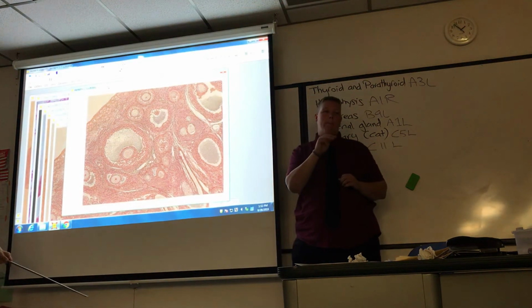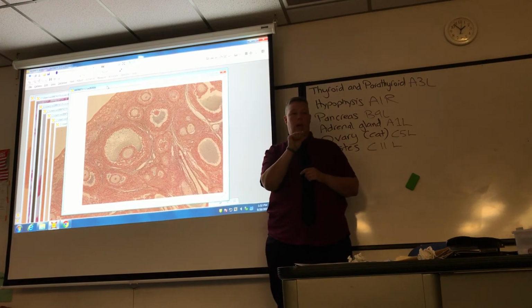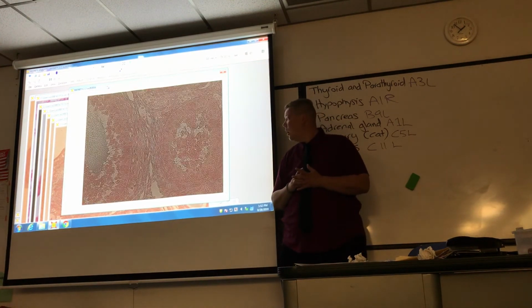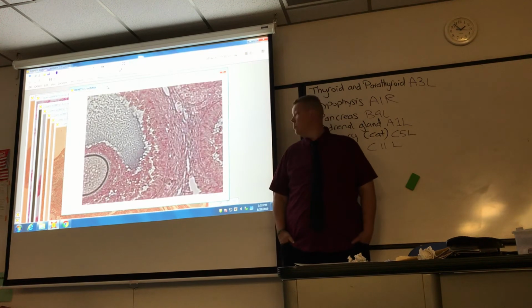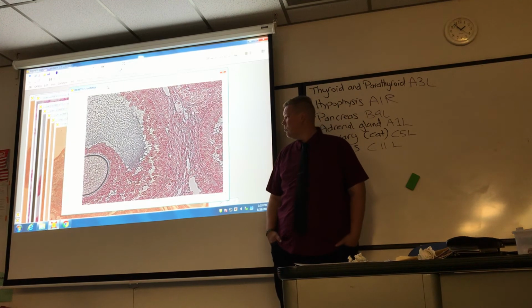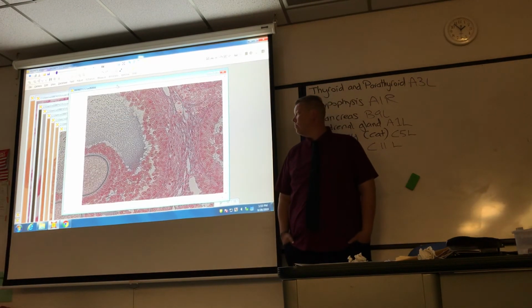Let's do a closer up view so we can see granulosa cells and theca. So which one is this?